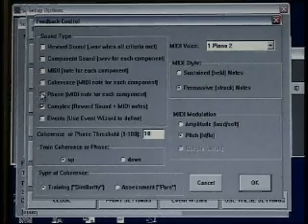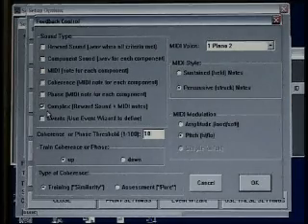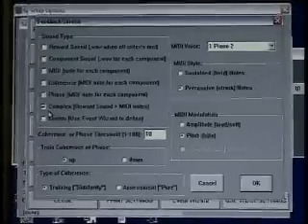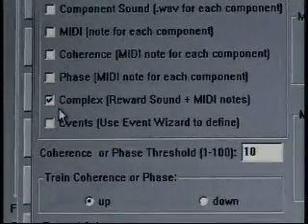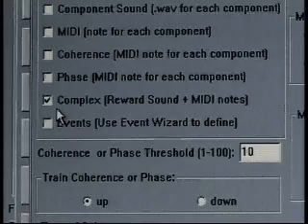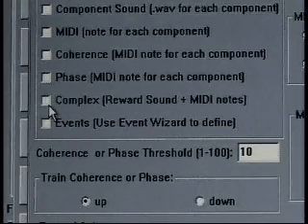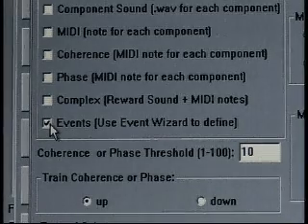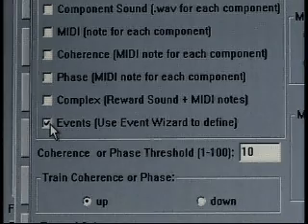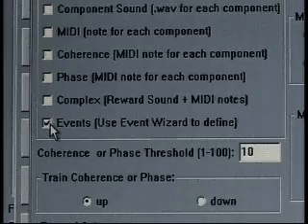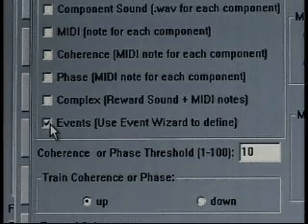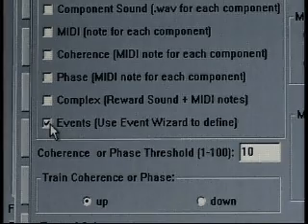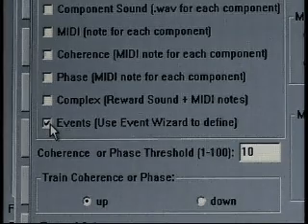Our next option is complex, which gives you a reward sound when all criteria is met and a MIDI note for each component — so this gives you a combination type of training. Our last option is events — use of event wizard to define. That's something we'll get into later; it gives you the availability to choose a different instrument per component and to define different events up to 16 different events, so you can really make your own little orchestra.